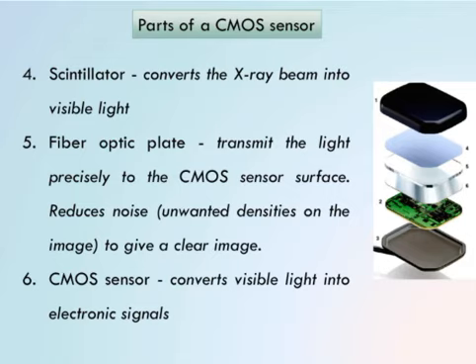So radiographic noise means, for example, if you have a classroom with the students only and the teacher is not there, then you can hear the different sound waves of each student which occurs at different wavelength. So someone from outside the room can hear noise. Noise means unwanted or non-uniform sounds coming. Okay?